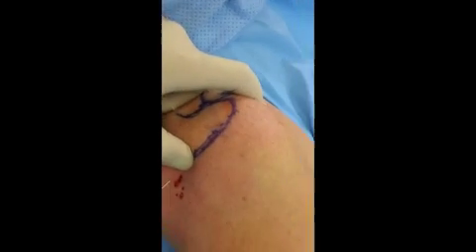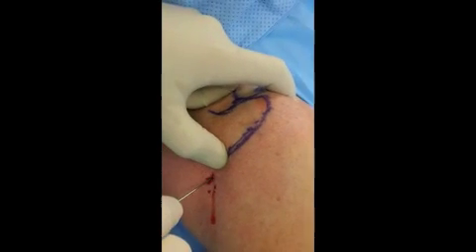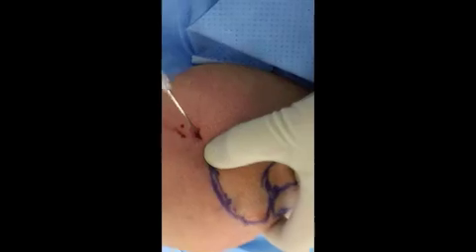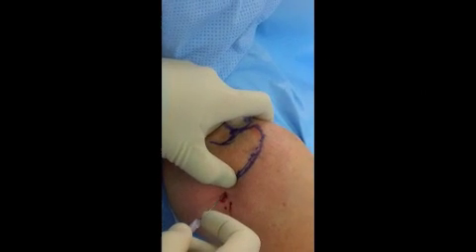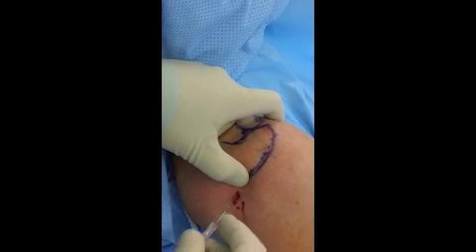Maintain your thumb right on the acromion as you keep the needle parallel to the ground and insert it in as you point towards the index finger. Again — acromion, coracoid — keep the needle underneath the thumb as you point towards the coracoid, parallel to the ground.